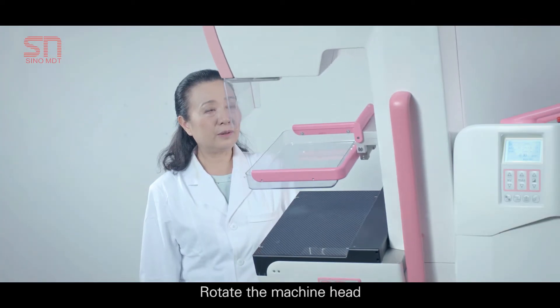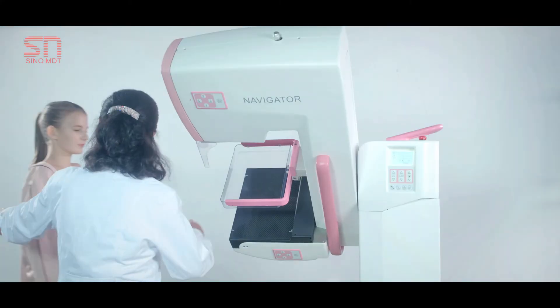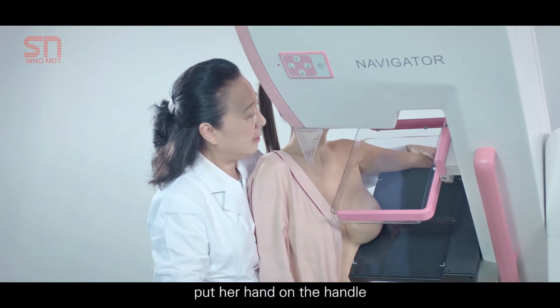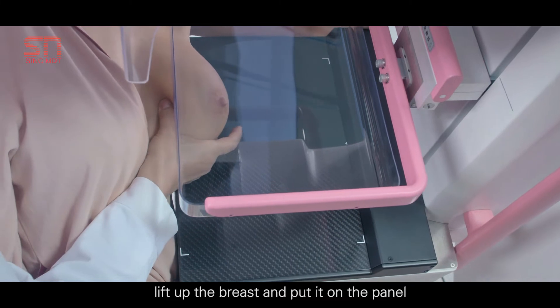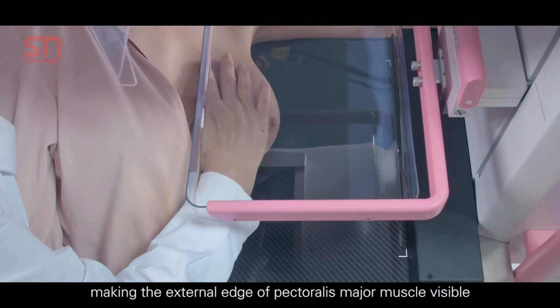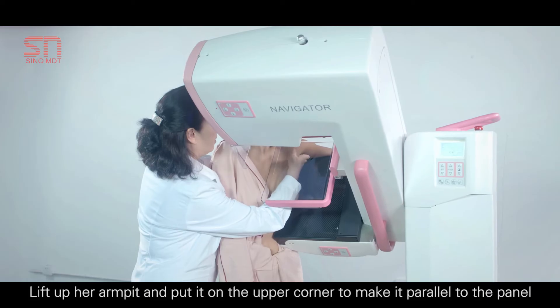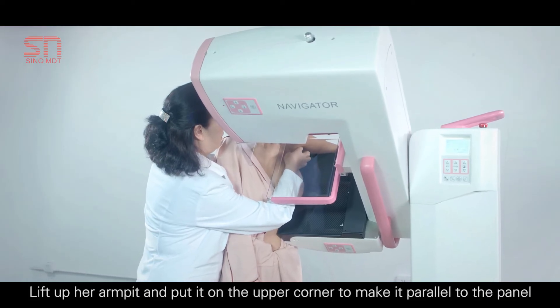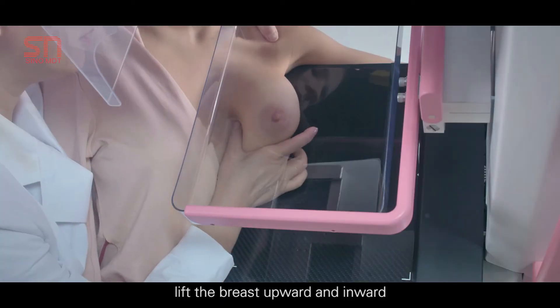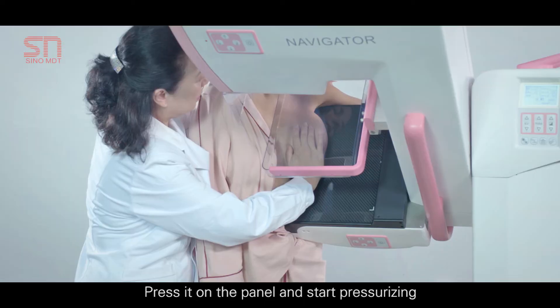Rotate the machine head. Put her hand on the handle. Lift up the breast and put it on the panel, making the external edge of pectoralis major muscle visible. Lift up her armpit and put it on the upper corner to make it parallel to the panel. Lift the breast upward and inward, then press it on the panel and start pressurizing.